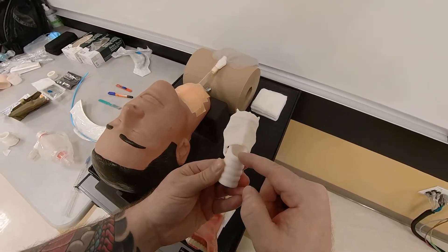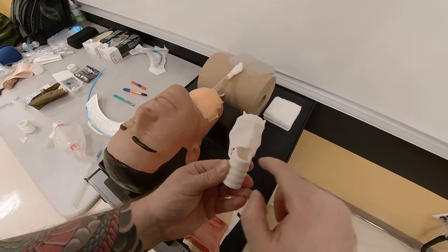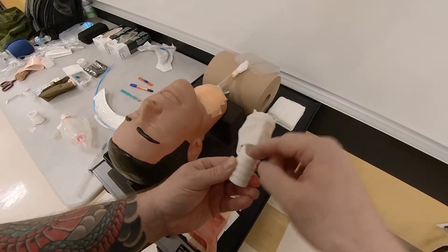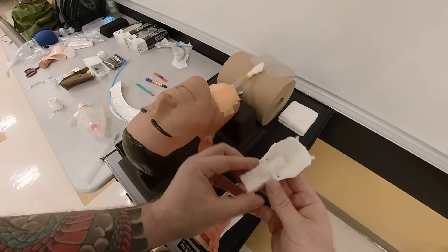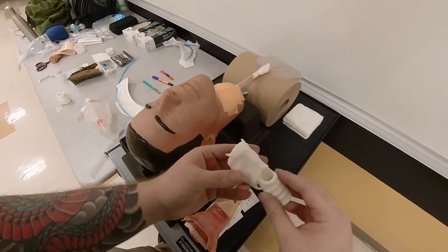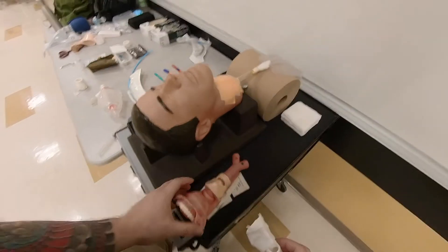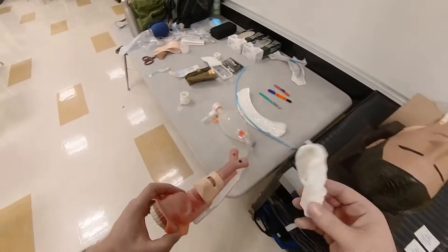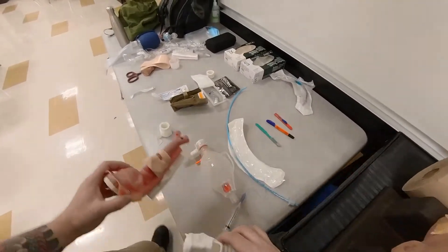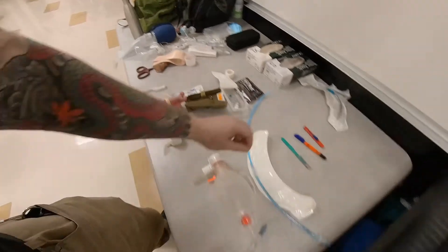You're going to make an incision — first vertical, then horizontal — and then place the tube in there. Now that you've seen the landmarks and there are no contraindications, we're going to go ahead and commence the procedure.